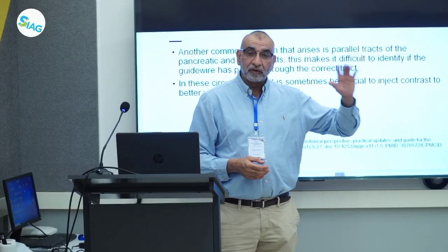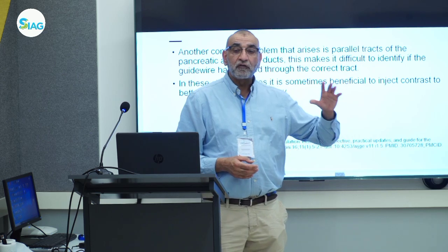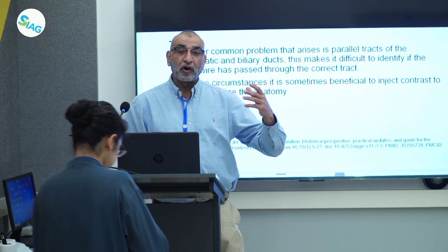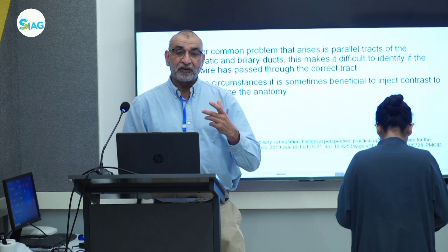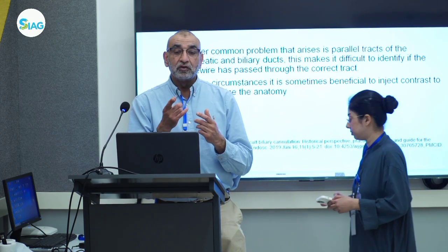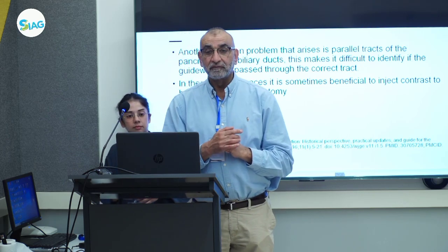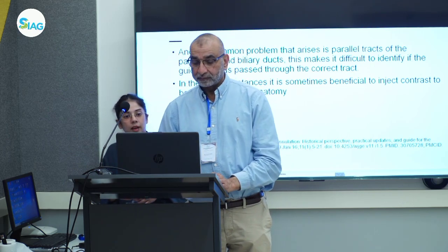Secondly, the other problem is whenever there's a stricture due to head of pancreas cancer, those are quite low lying, and they can affect your cannulation because you have very little space to maneuver. आप फल्क्रम नहीं कर सकते उसको.